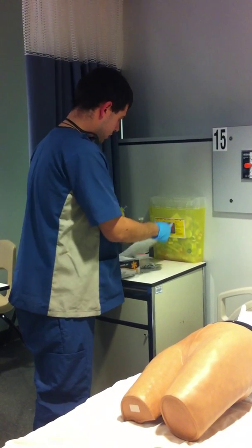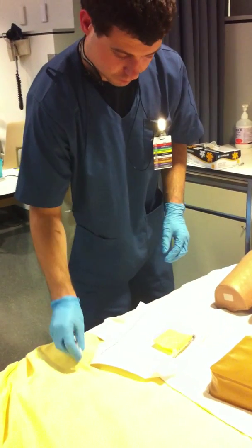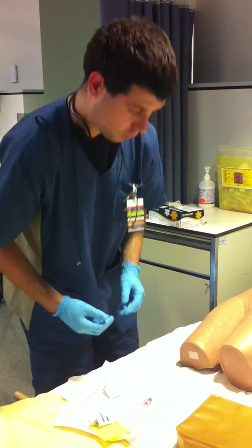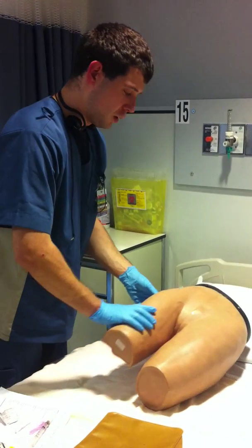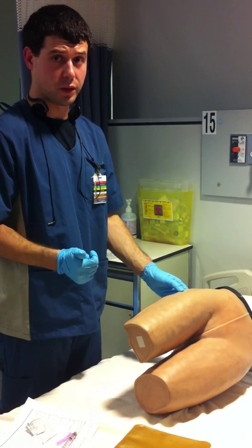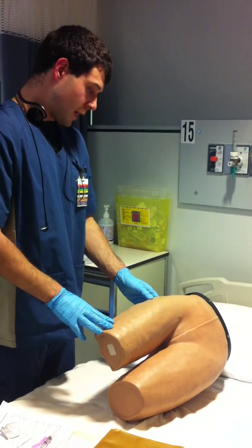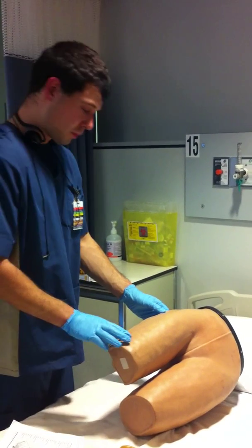Okay, now I'm going to take my materials over to the bed. Okay. Mr. Tutu, I'm going to get you to lie on your side for me. Please turn over. Once Mr. Tutu is on his side, I'm going to assess for any bruising, swelling, redness. If I see any of those signs, I cannot administer the medication at that site, and I need to pick a different IM site to inject. I see no bruising, I see no redness, and I see no swelling. I can begin to landmark the area.